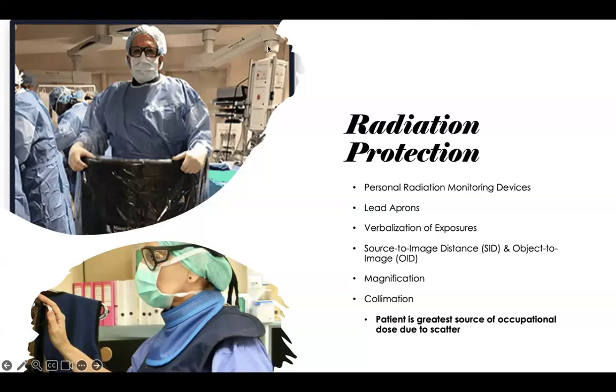One thing to remember when using the C-arm or fluoroscopy is that your patient is going to be your greatest source of occupational dose due to scatter. So just keep that in mind. The patient is going to be the source when you're using fluoro.